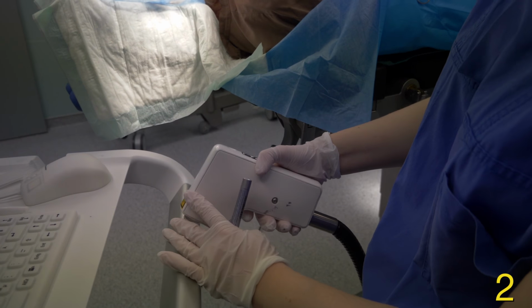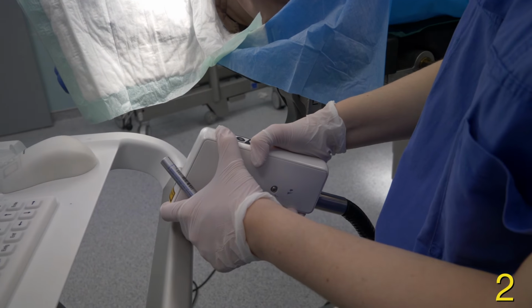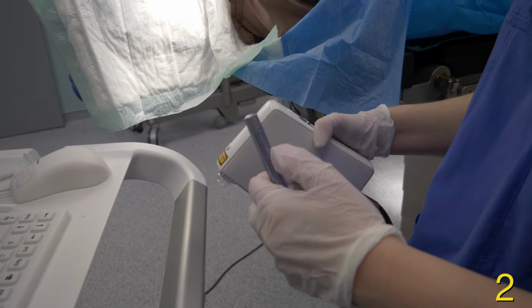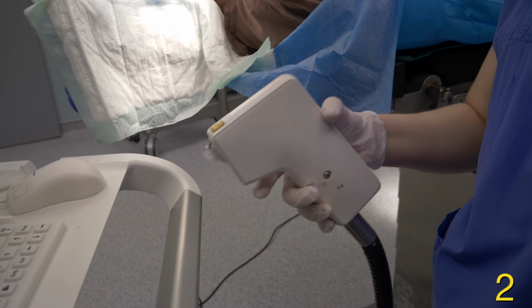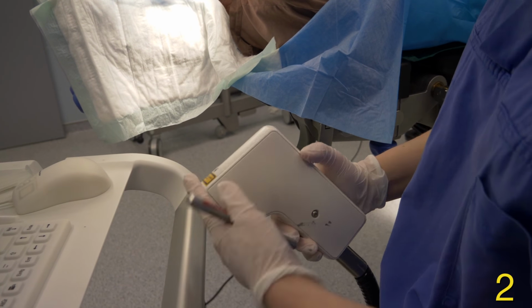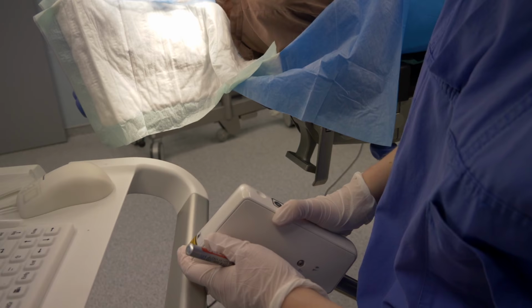I have it here in my hand, and then I adapt it like this or also like this to hold it still. Okay, so the fingers are kind of against the skin. Yes, because I'm always a little bit shaky, you know. There are some people who have very still hands, but I always like to do it like this or even like that, you know, to cover it, like really to hold it firm.